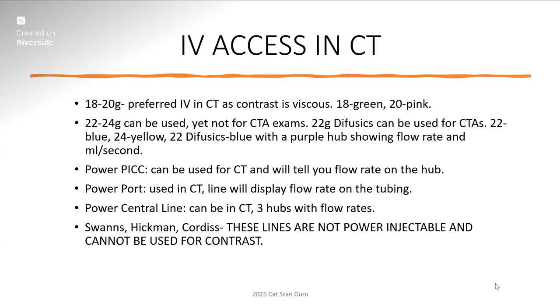So please do not, because they are not power rated and you cannot use them at all, okay? You can get in a lot of trouble, and I've seen a case where somebody used a Cordis, completely cracked the tubing, and the patient had to immediately go to the OR because they had a clot, and it was just a hot mess. Do not use these lines. If they pressure you to do it, no.